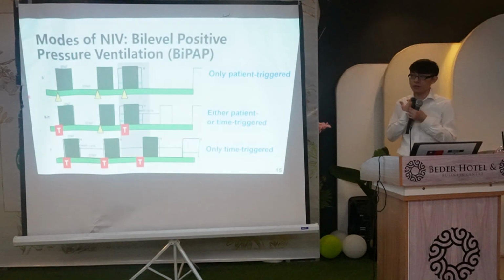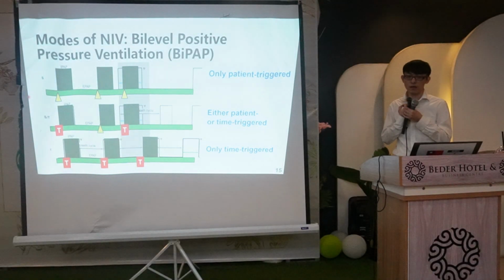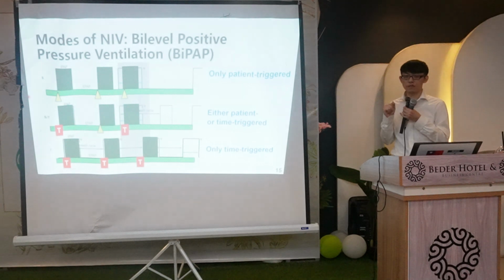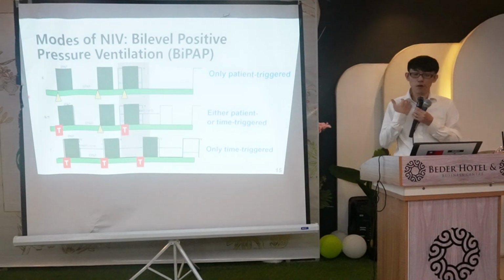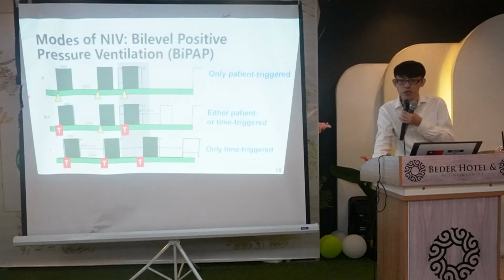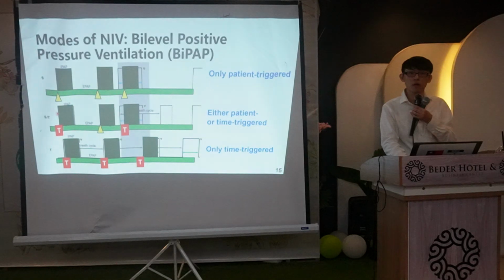If the patient frequently has apnea, which mode can you not use? S mode, right? Because it requires sensing the patient's trigger. Usually for us, because sometimes we don't know the breathing pattern of the patient, in our hospital we usually set ST mode. We seldom use S mode.